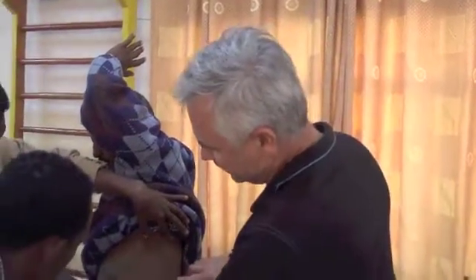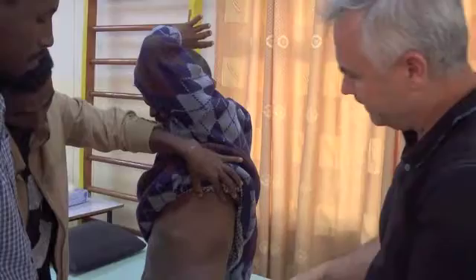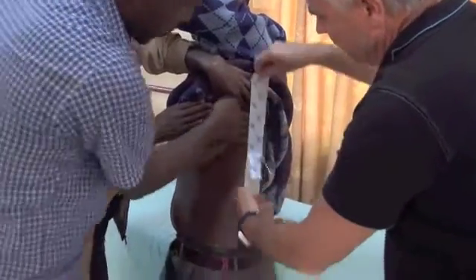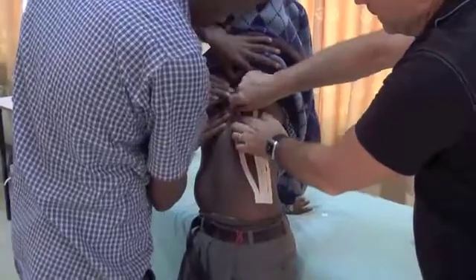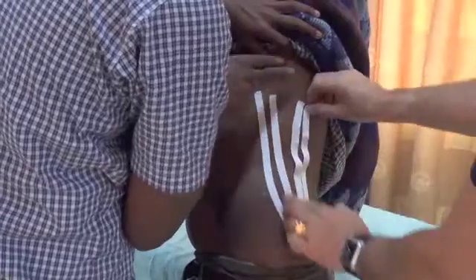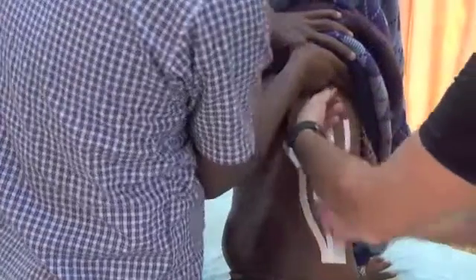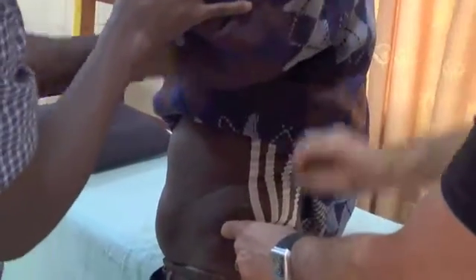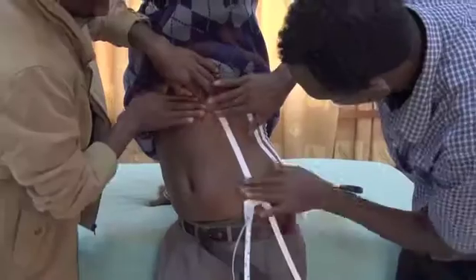We have very long scar tissue, lateral. Patient suffers lots of pain. So we're going to apply the tape in this direction. So stretching — not excessively — turn and then go to the back, like that. So just bring down the arm; you see here that the tape is working. Here the skin is elastic in this direction.